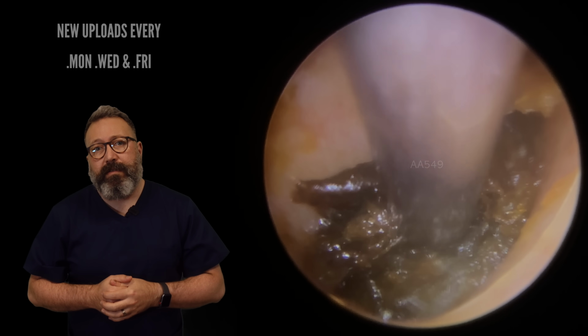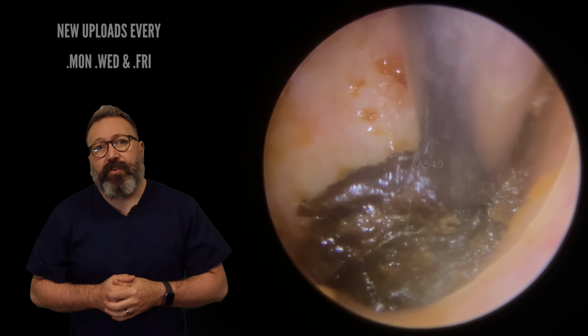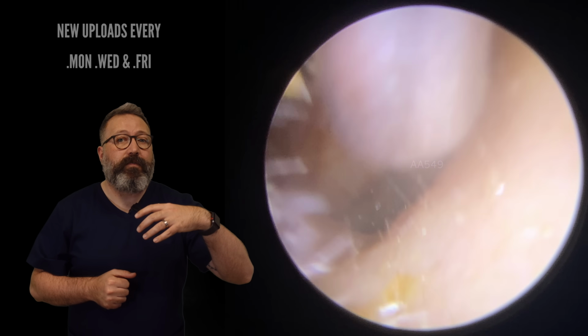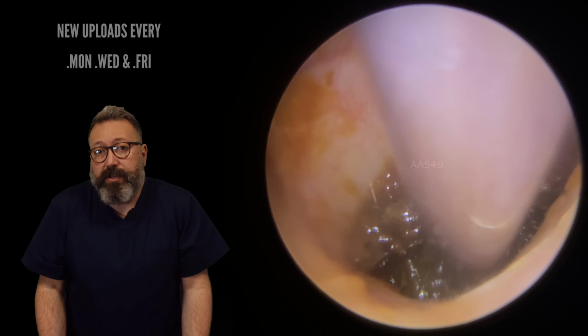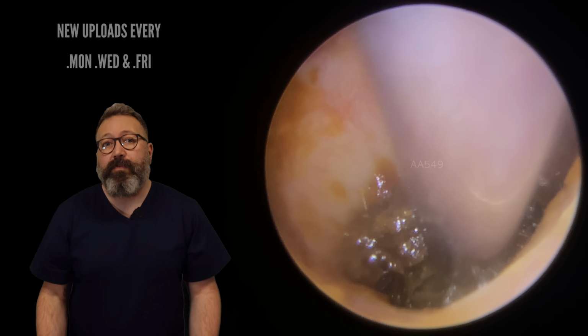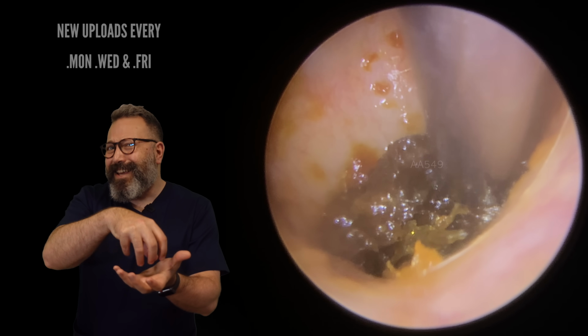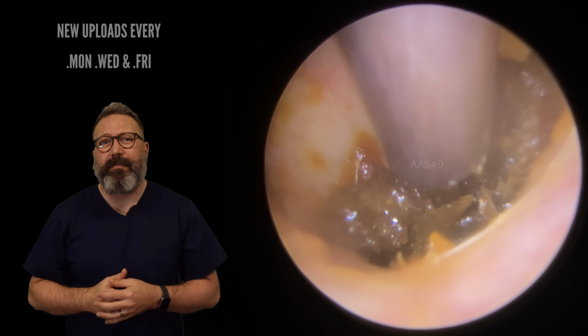I want to try and peel this down away from the drum for two reasons. First of all, it's going to help the patient to hear a lot better straight away as this starts to come away from that eardrum. But the other thing is, we're going to have to lift, which is what you can see me starting to do here. Now, if we've detached a lot more of the top section, when we do perform the lift, it's more likely to draw this whole thing out. There's a lot of dead skin down in that recess, though. As I'm kind of pulling this, I can see little bits of dead skin coming away here.